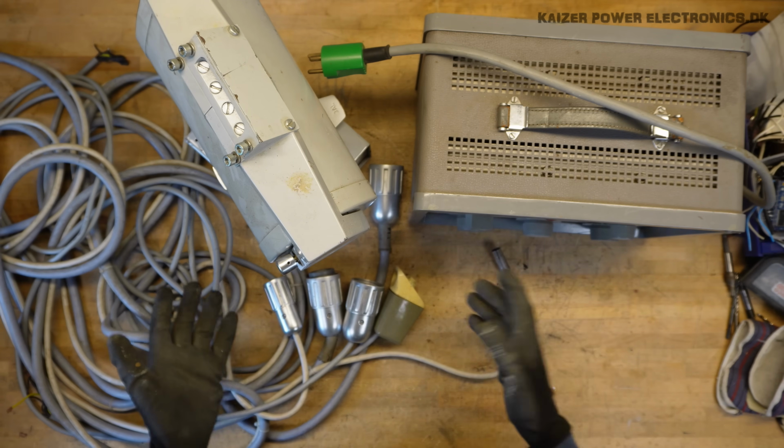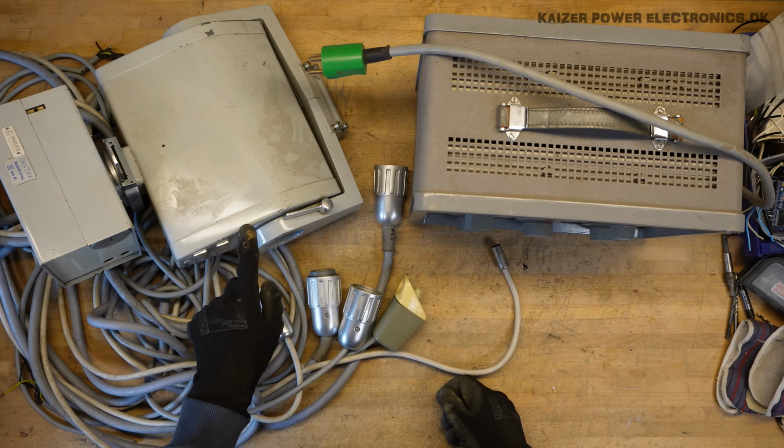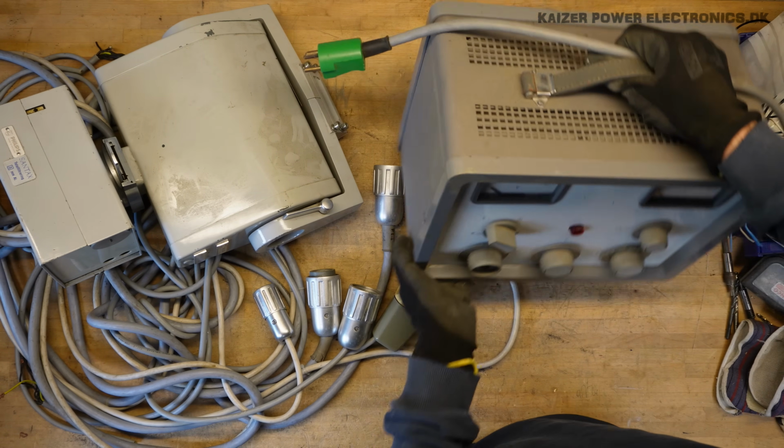Let's run through the system. The X-ray head and tank has started leaking oil. That's pretty bad. So it has been leaking oil down through the inverter box over here. So let's take a look at that.